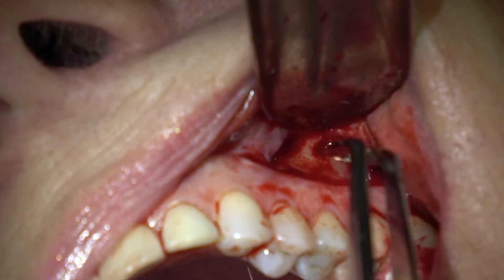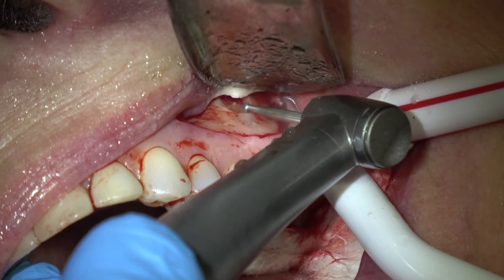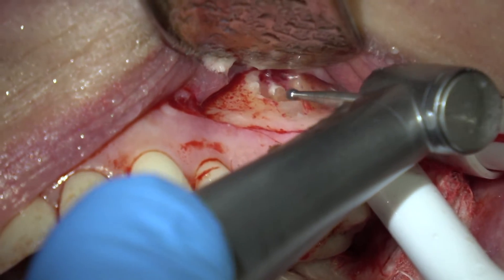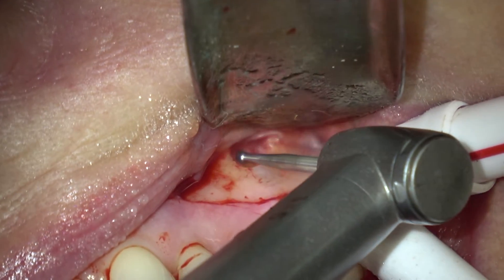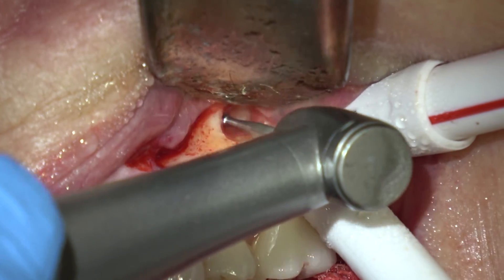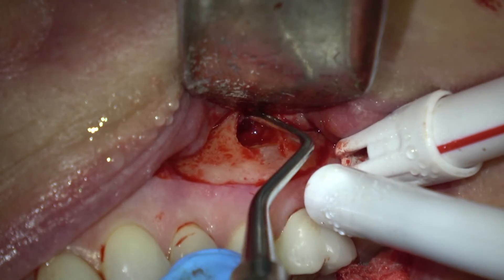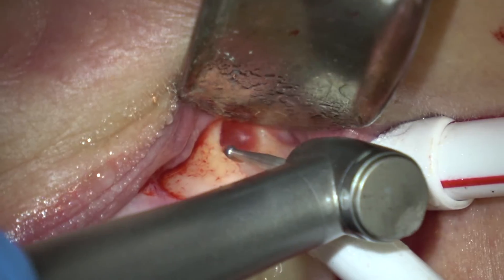I know I'm in the right location — you can see the gutta percha down there and there's the root of the tooth. Now I'm just cutting off the root of the tooth. That root was just partially filled. I'm very lightly cutting the root and now I'm curating any granulation tissue with this small spoon.